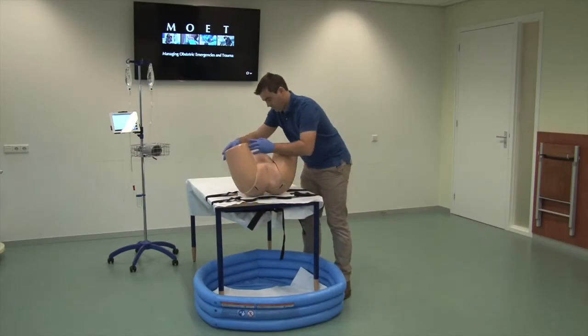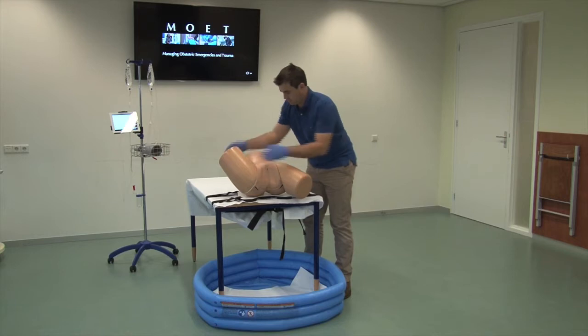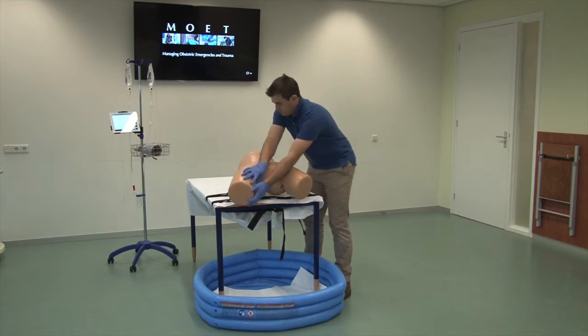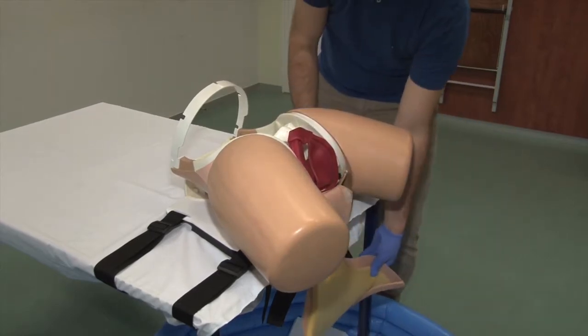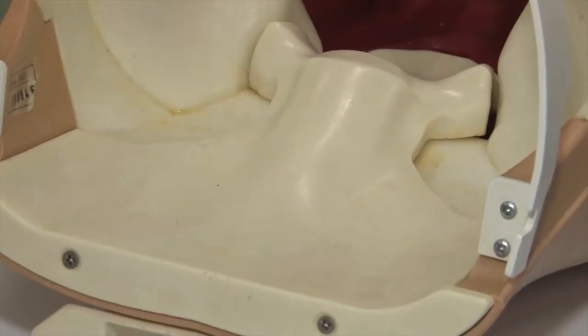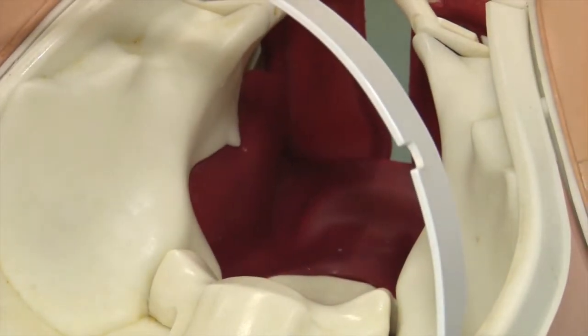The instructor installs the pelvic manikin on the edge of the table or on the delivery bed as appropriate. The manikin must be able to be installed in the lithotomy position. The pelvic manikin we used is a PROMPT trainer. While not designed for this purpose, the materials used are waterproof.